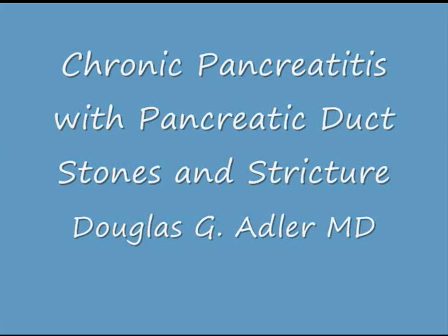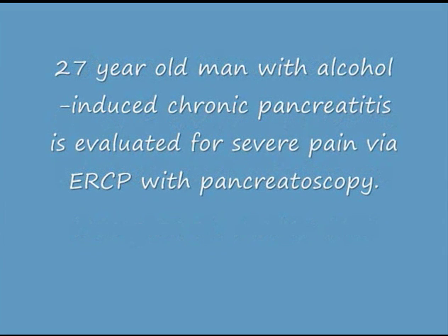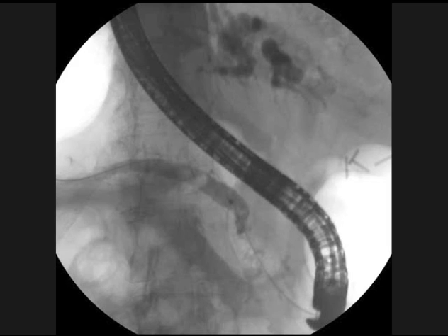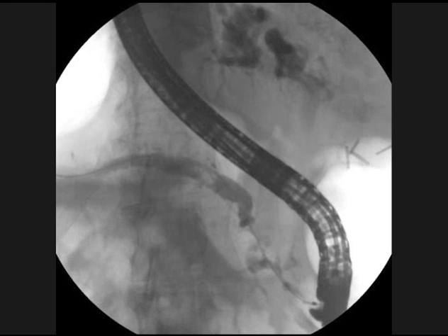Chronic pancreatitis with pancreatic duct stones and stricture. A twenty-seven-year-old man with alcohol-induced chronic pancreatitis is evaluated for severe pain by ERCP with pancreatoscopy. The initial pancreatogram shows a grossly dilated pancreatic duct, multiple filling defects, and a stricture approximately one to two centimeters long at the level of the pancreatic genu.